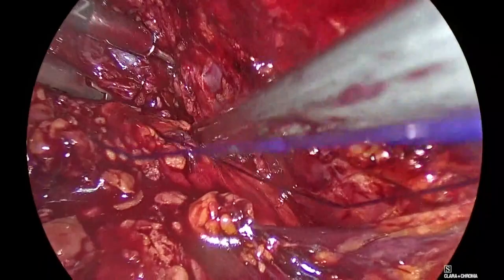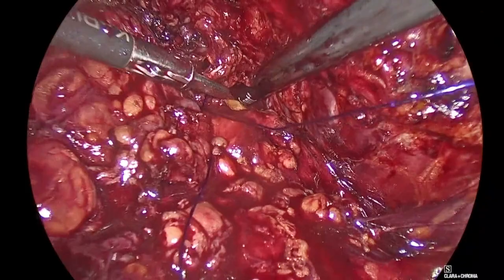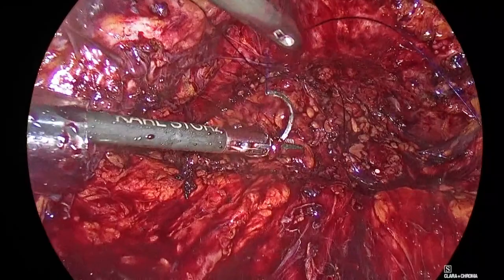This is my final stitch on this side. Good. Go back. Okay, and this is the inside out again on the bladder that I will put on this side. Go out with your suction, Panagiotis, which I put from the trocar on the side of my assistant.